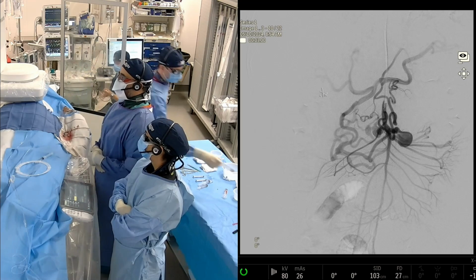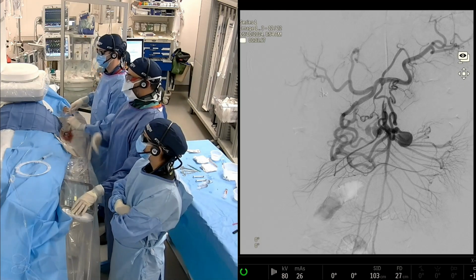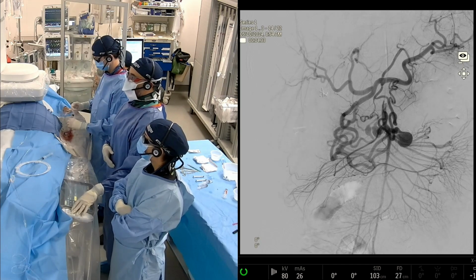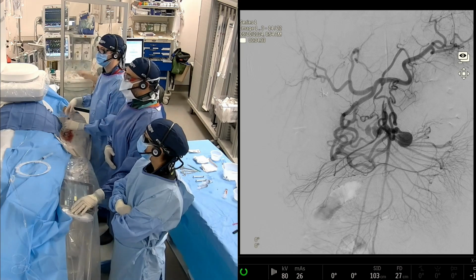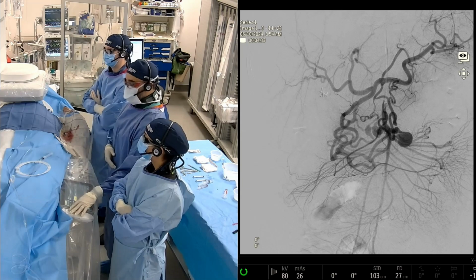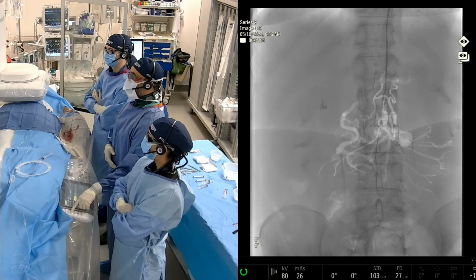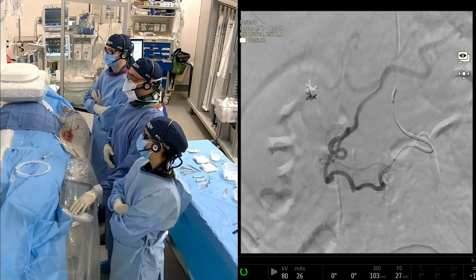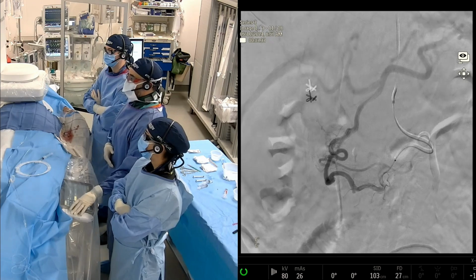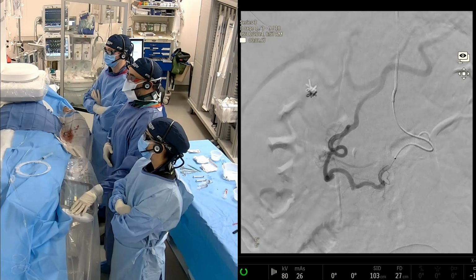All right, so this is the SMA angiogram, again showing multiple aneurysms, some larger than others, off the collateral pathway back to the celiac artery, which is being revascularized by these collaterals coming off the SMA. We were hopeful that some of these will be coming off the same trunk, so we don't have to catheterize multiple branches. But we figured we'll start with the big one first and then work our way around. Here you can see we got into the aneurysm and were able to get to the outflow of the aneurysm. We did a run on the other side, which is whether it's the anterior or posterior division of the IPDA, I'm not really sure. You can see there's no real aneurysms off this one.